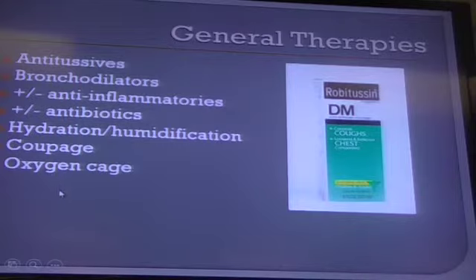Nasal oxygen actually helps you to take your patient to do things. If my patient is oxygen dependent, and I can cart the oxygen with my patient, then I can take him to radiology, he's still getting oxygen, and I can get the study that I need. Instead of, let me pull him out real quick and see if I can get this done, and crap, he's struggling, I didn't get any good films, and now I have to throw him back in oxygen. So just understand the limitations of your oxygen.